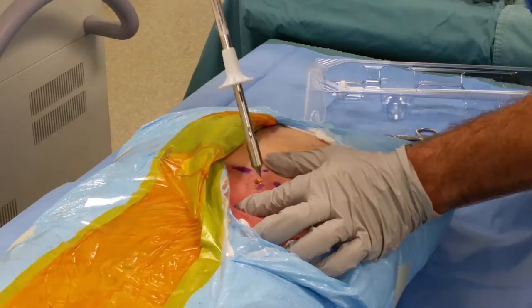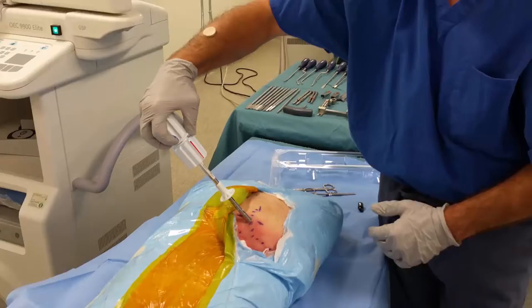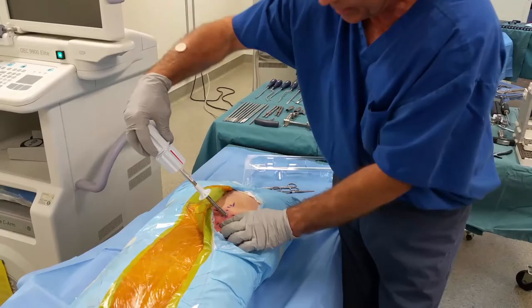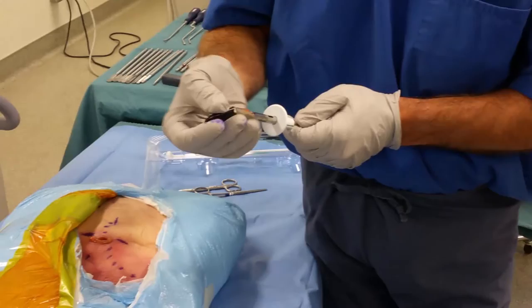The trocar tip is going to sit on the bone, and it's an oscillating motion, just like that. If you notice, I'm coming in at an angle about 30 degrees from vertical. A lot of surgeons will erroneously go posterior to anterior, but that's not how the pelvis goes, so you want to make sure that they don't. And there's a stop on this, so I'm not going to go too far.